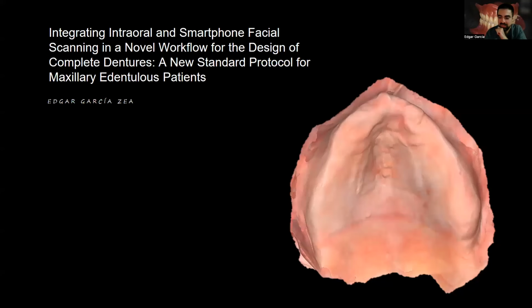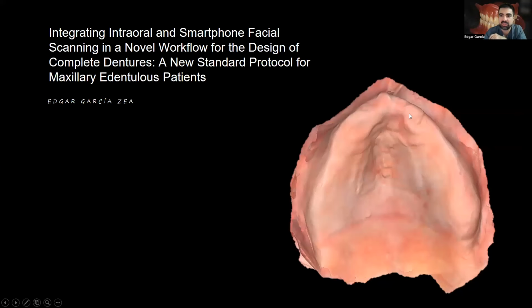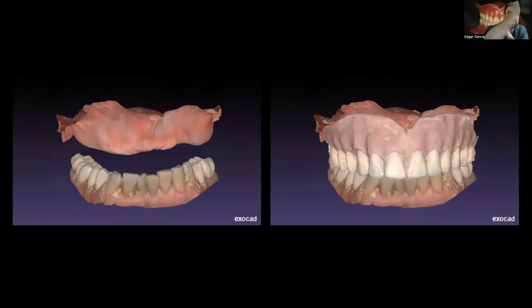What I think is the only way that we can do dentures without impression materials is with the upper one. In this case, this patient had a flabby ridge. It was not a super extreme flabby ridge, but she had a flabby ridge in this area. So I scanned the maxilla.